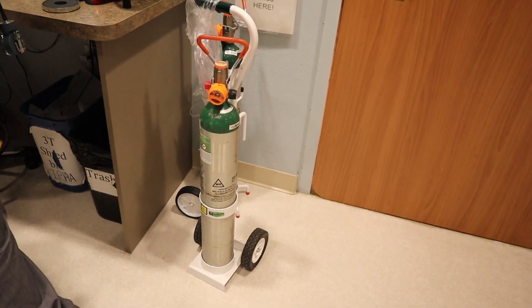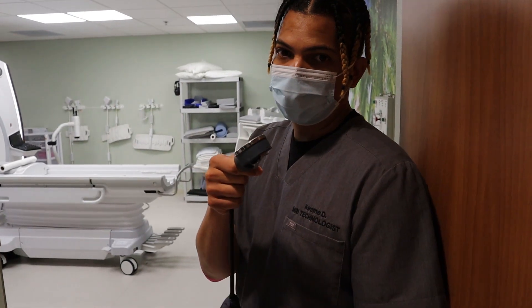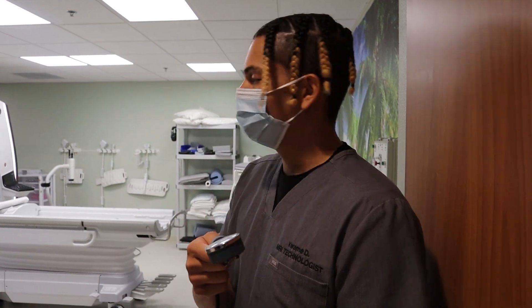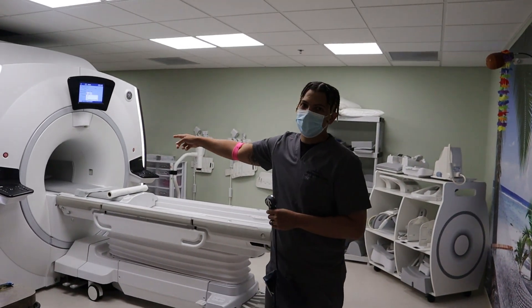I'm gonna show you why you don't want to bring metal into an MRI. Don't try this at home, don't try it at work — do not do this. This is trained professionals with EMTs on site. This is a three tesla MRI.